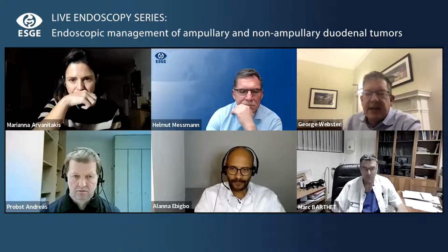You can follow it. There have been some questions actually about polyposis syndromes and sporadic adenomas, and whether there should be a different endoscopic approach to resection, whether the patient falls within a polyposis syndrome, FAP, for example, versus sporadic adenomas. Marc, do you have a view, or would you just assess and resect according to the appearance, independent of whether this is part of a polyposis syndrome?